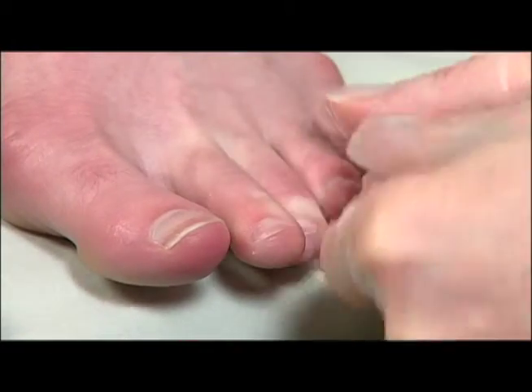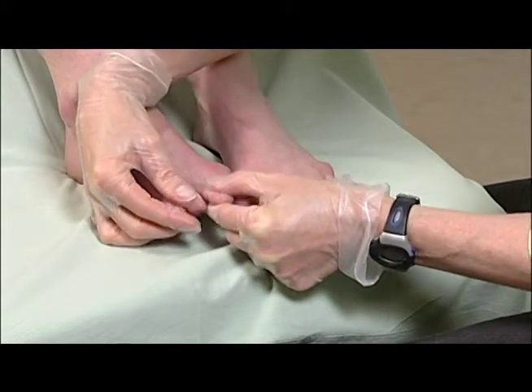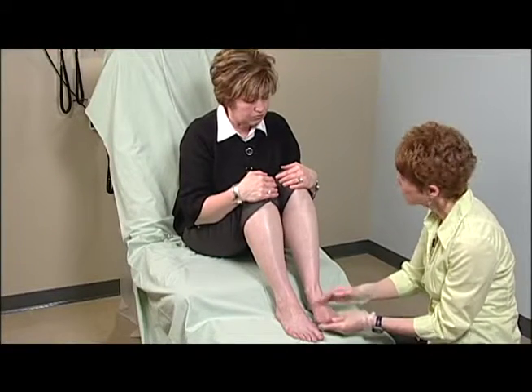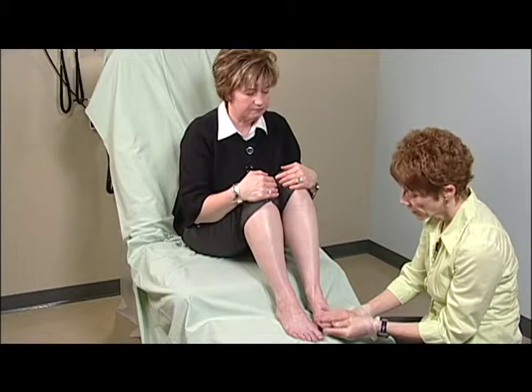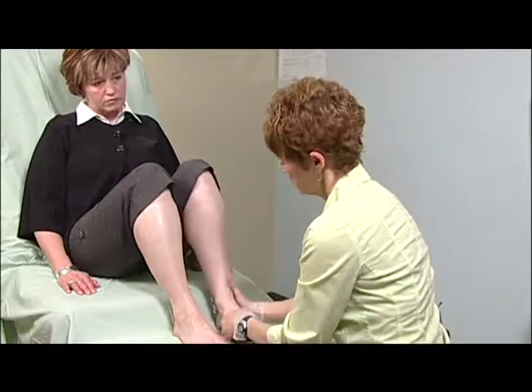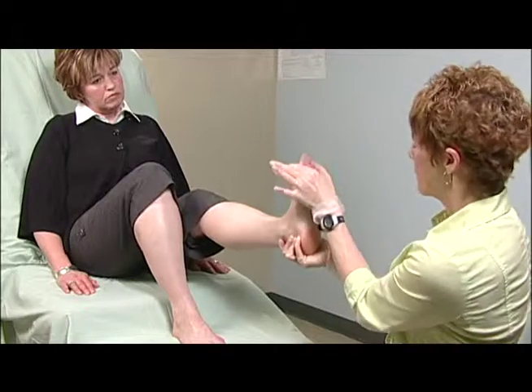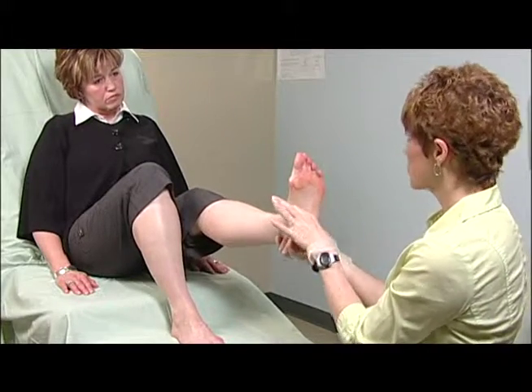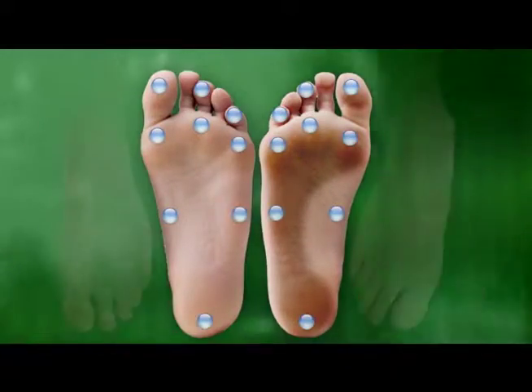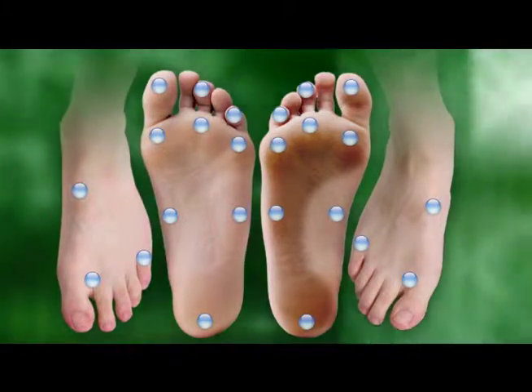People with diabetes want to avoid foot infections which may occur if the skin becomes broken. Ask the client who cuts his or her nails and if there are any problems. If needed, a referral can be made for assistance with nail care. When examining the foot, note an abnormal foot shape, swelling, increased foot temperature or redness, and weakness. In Saskatchewan, we recommend testing 12 sites for sensation on each foot using the monofilament.